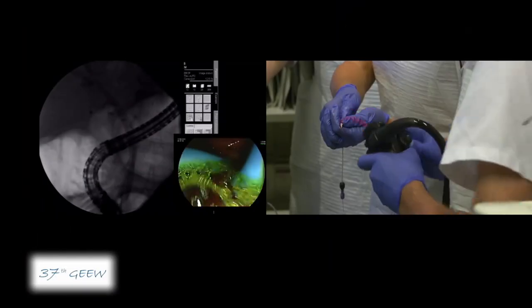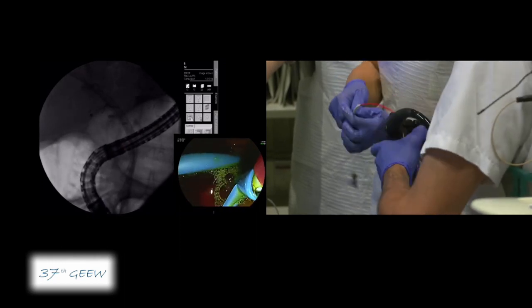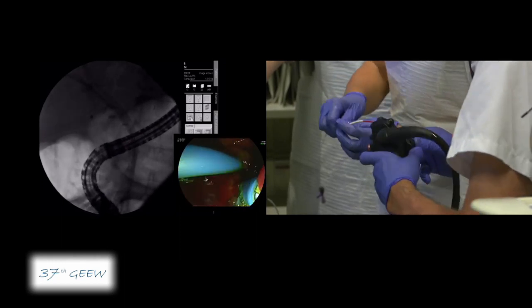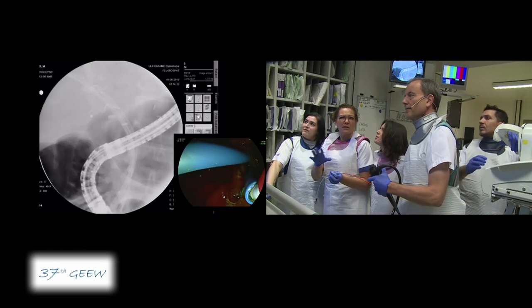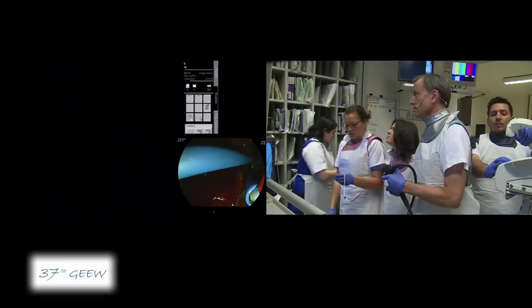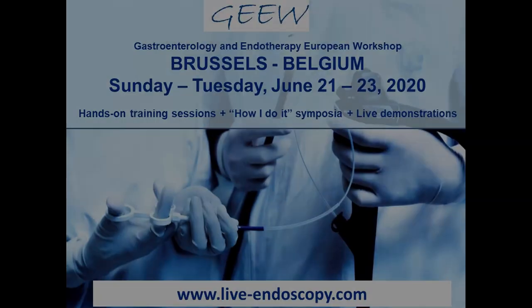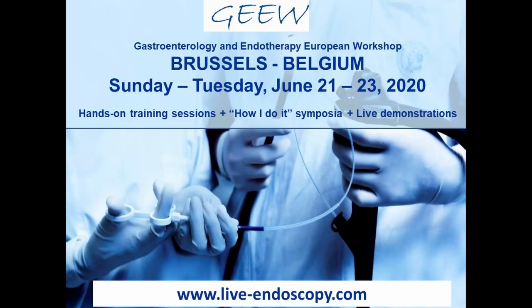Still the bluish color — this is the end of the balloon. We can now inject contrast to visualize. Let's begin with the stenting. Thank you.